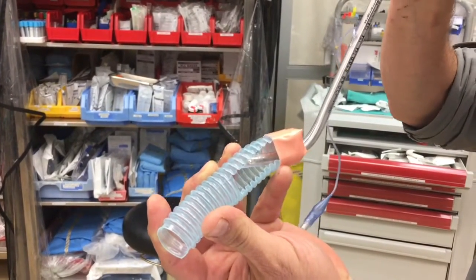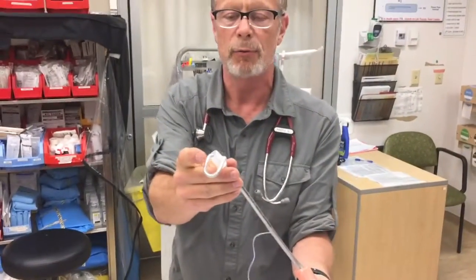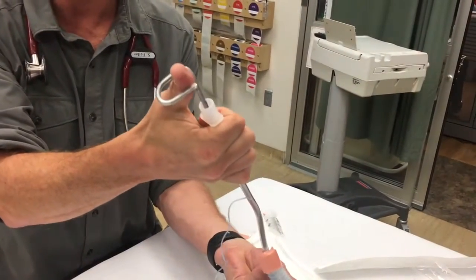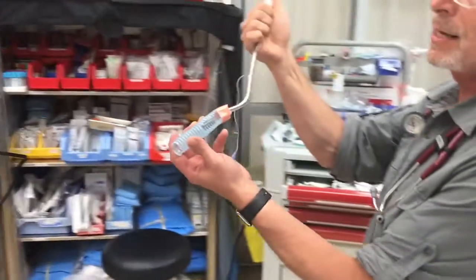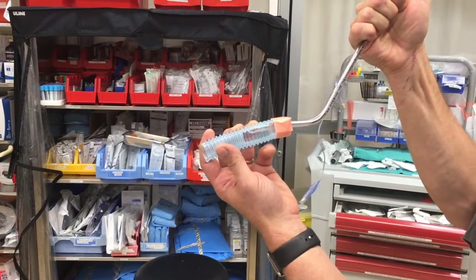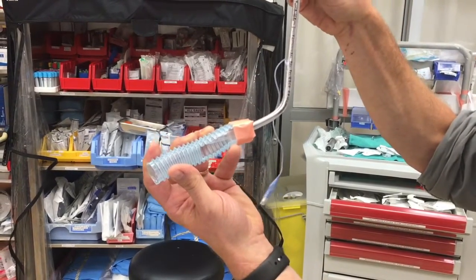The two corrective maneuvers: one is I always have my stylet bent proximally to the left. What I can do is come up here with my thumb and do a quick thumbs up — all I have to do is come up three centimeters. That makes the end of the tube soft and it's not going to get caught on the tracheal rings.